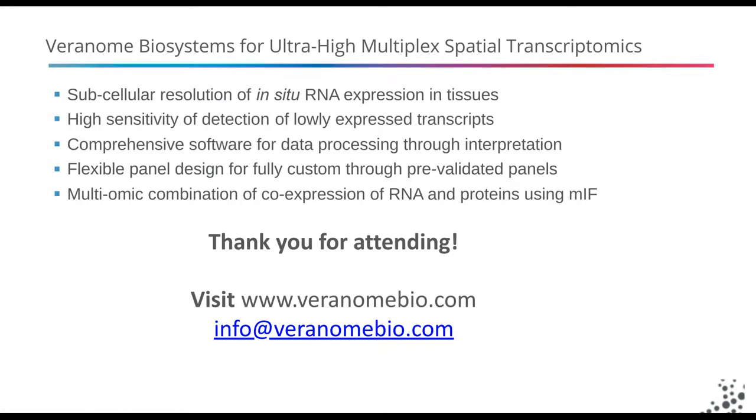The second stage is simply loading the processed image file into the Veriscape browser. The file is usually read in and ready in a few minutes. Analysis can be undertaken immediately. There's really very little data preparation and downtime, and the desktop application will process algorithms to produce t-SNE plots and clustering and image rendering almost in near real time for most of that. So that's the overall time frame, going from imaging on the system to analysis probably within 3 to 4 hours.